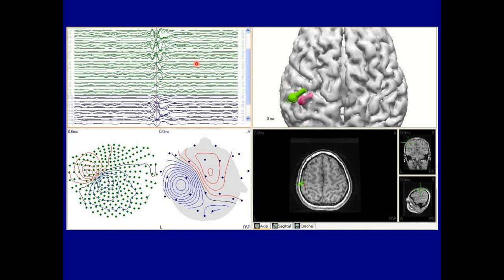Here's a spike from benign Rolandic epilepsy. Here's the MEG spike. Here's the EEG spike. Here is the MEG field. Okay, we have an efflux maxima and influx maxima, the sources between the two maxima here. Here is the EEG field of the same spike. Notice that the orientation is orthogonal, and the maxima are much farther apart. Here's the dipole models of both being relatively similar. So on the surface of the head, the MEG fields and the EEG fields are usually orthogonal to one another.